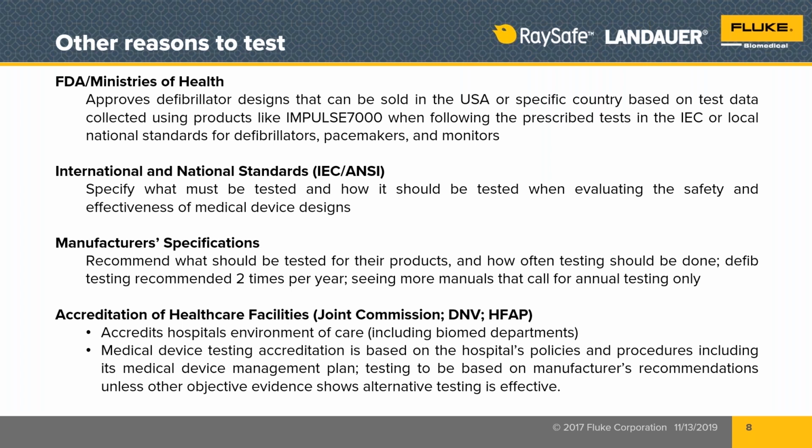In the United States, the CMS, which is the part of the US government that regulates whether and how much the hospital will be reimbursed for cost of care for Medicare patients, and then that rolls down to each of the states in the United States to Medicaid patients, has some requirements also. And they look to these accreditation agencies to verify that the testing has been properly done. And there's where the requirement for following the manufacturer's service manual procedure is a requirement, absolute. You cannot avoid it. You should be doing it.